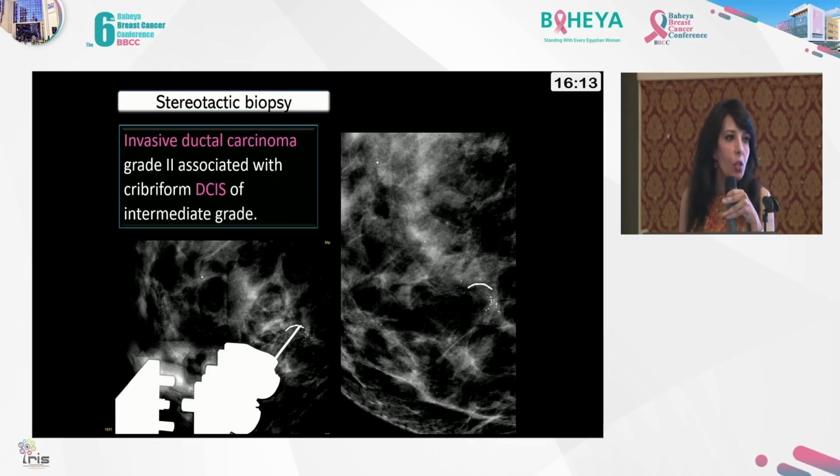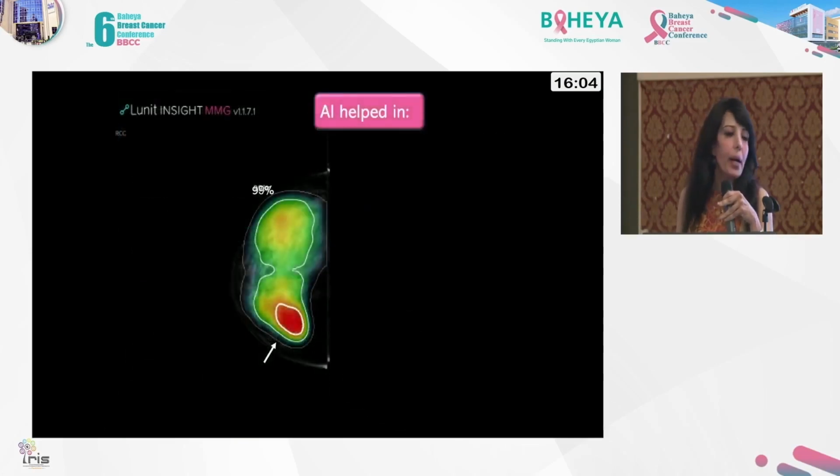So I may consider to biopsy the upper part in order to confirm if the AI is telling me the truth about the extension, because the patient will have her breast removed. From where am I going to take the biopsy? The whole breast is involved. Maybe I take the biopsy from here in the upper outer quadrant because it's the one proximal to me for the first vision, with the calcification involving the whole breast and the increased density involving the whole breast. So it's the one accessible to me in the outer portion of the breast.